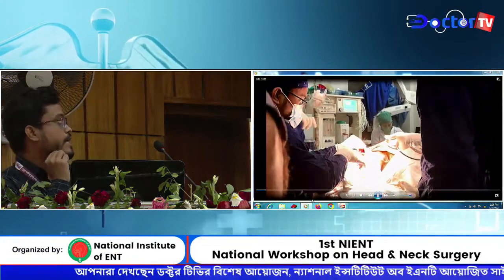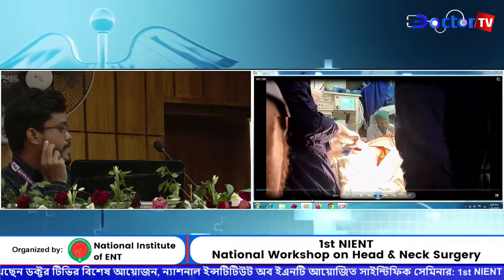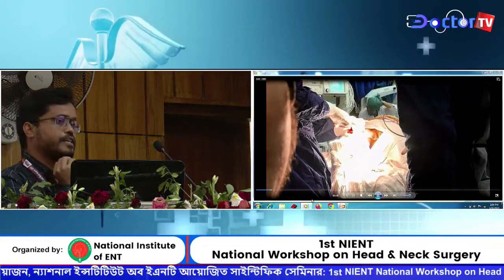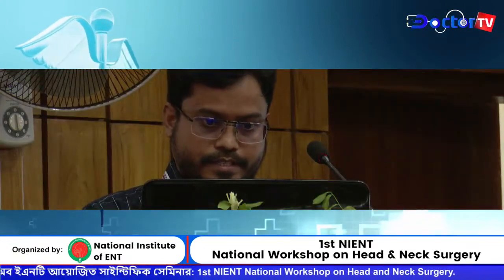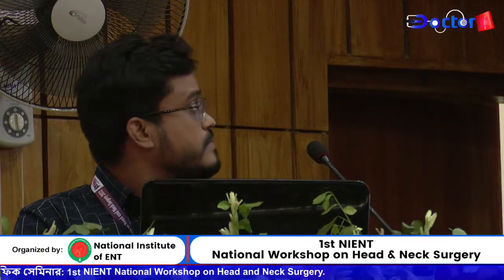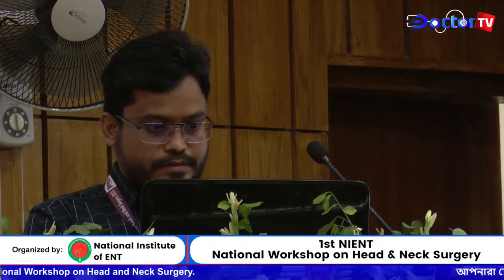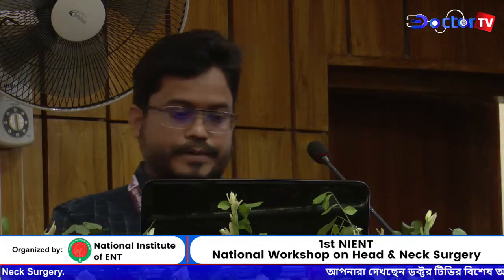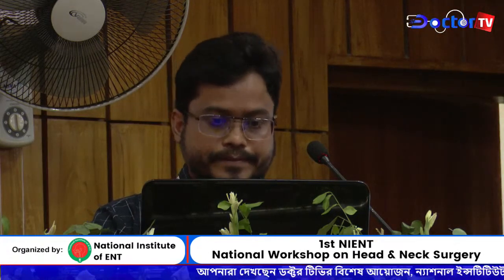This operation was done at Shaheed Suhrawardy Medical College Hospital 2 days before. Our respected Professor Matin sir, Professor Sajan Kabir sir, and Dr. Saifuddin sir were there. I am trying to meet the central port for insertion of the camera, a 10 mm 30-degree camera.